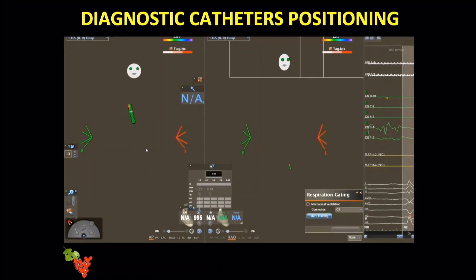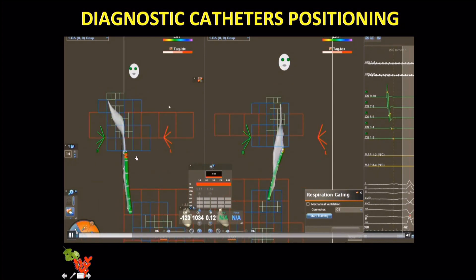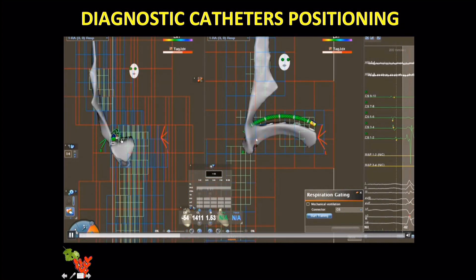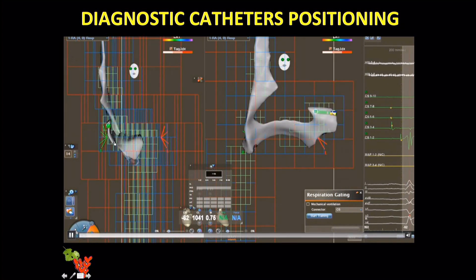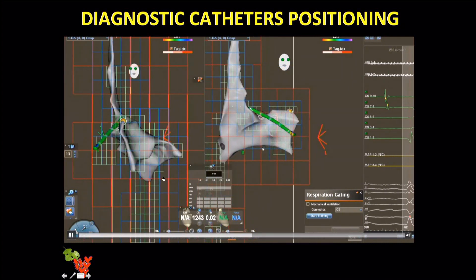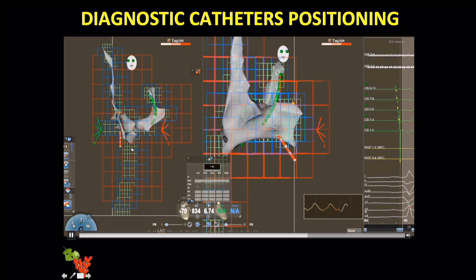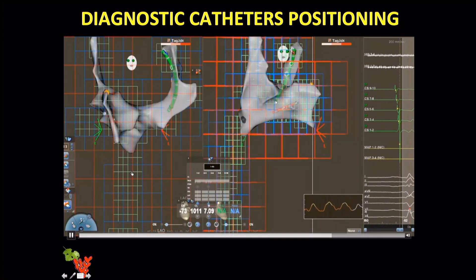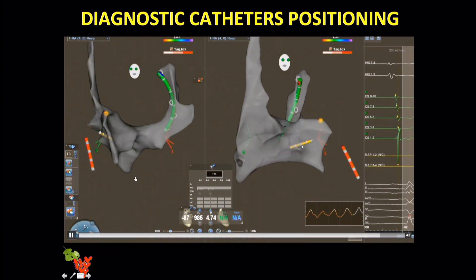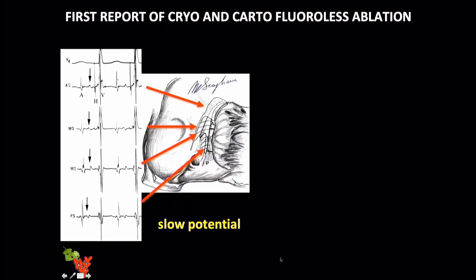Moving upward toward the compact node, the timing changes — the potential appears between the atrial and ventricular potentials, and an His signal appears. This is very important for performing a safe procedure. You can navigate the chamber without fluoroscopy by creating a matrix, reaching the right atrium, then unveiling the His bundle potential reference, rotating clockwise and withdrawing the catheter to engage the coronary sinus without fluoro, and placing a tetrapolar catheter in the ventricle using the matrix.